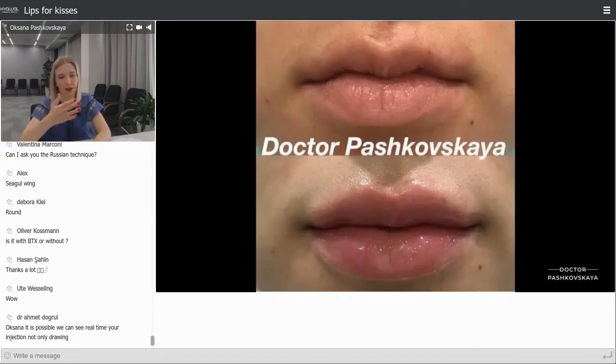And also finally the seagull wing. Alex, it's for you. The seagull wing is now in the picture, and you see that we try to reopen that part of the upper lip, try to lower it, to drop it, to put it on the closure line. And I used the vertical, not vertical, but fan shape technique, not from the corner of the mouth, but more medial.